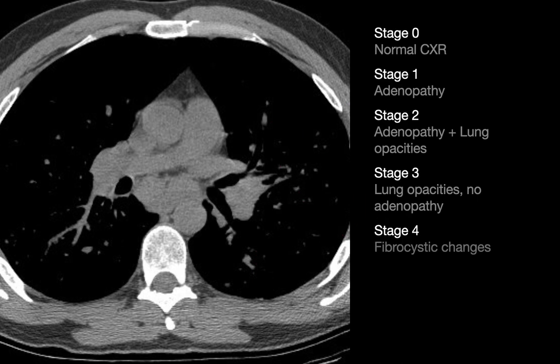Here is a summary of the stages of radiographic sarcoidosis. Stage 0 is a normal chest x-ray. Stage 1 is just lymphadenopathy. Stage 2 is lymphadenopathy and lung opacities, probably referring to nodular pattern findings — perilymphatic or bronchovascular — and maybe reticulation. Stage 3 is lung opacities but no lymphadenopathy. Stage 4 is end-stage fibrocystic changes.